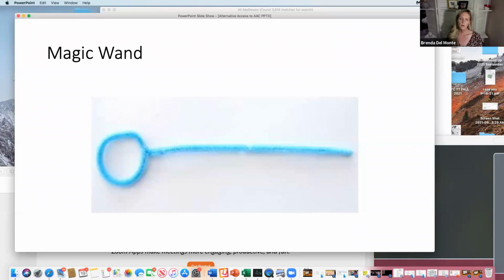And I do that also because if you bring your hand in front and you're talking, your arm is likely blocking part of the cameras for the kids' eyes. So I'm pointing right at it, I'm saying it, and they're not even looking. I can't even find their eyes in the little green box anymore. And that's because your hands are crossed.